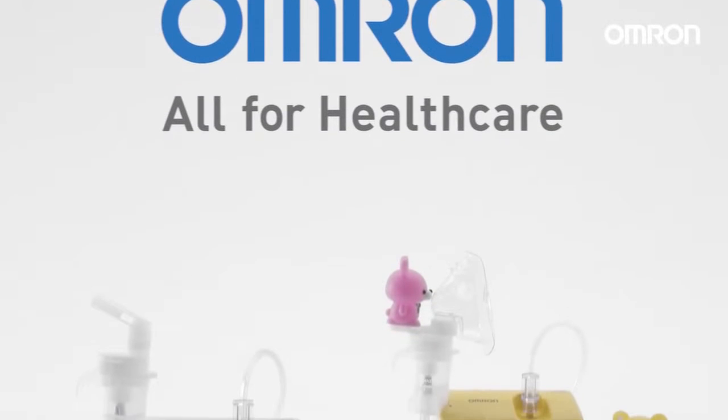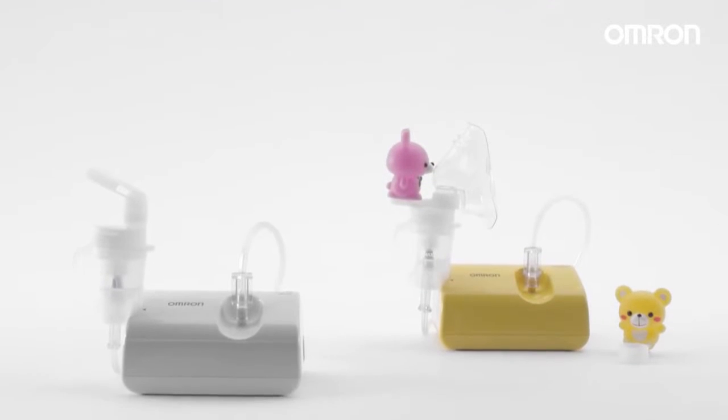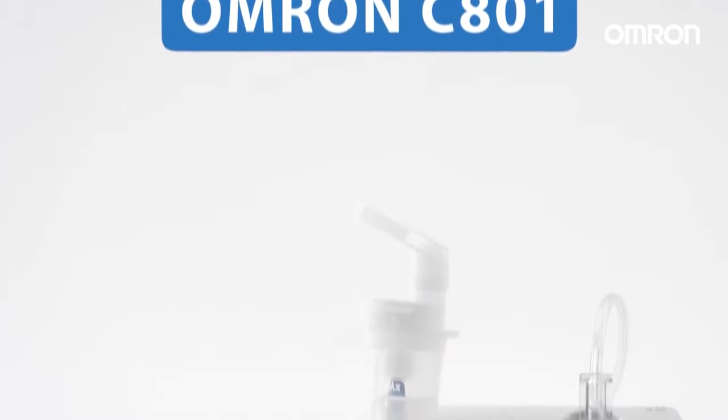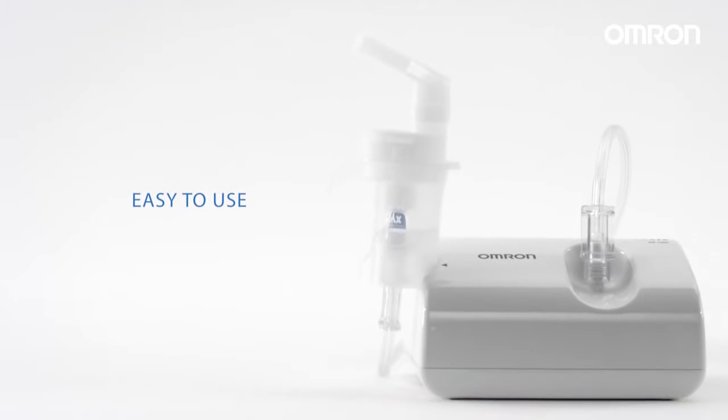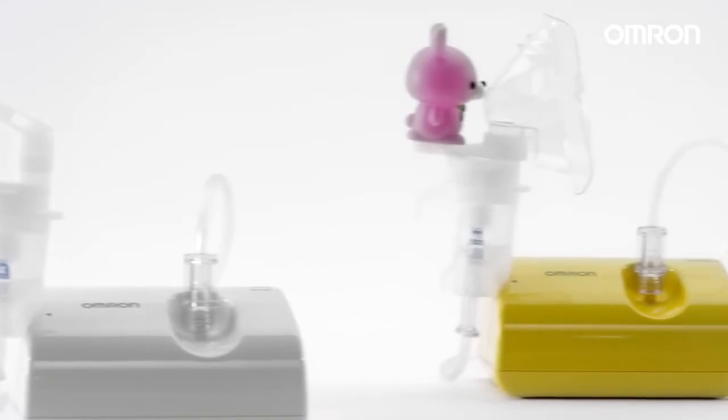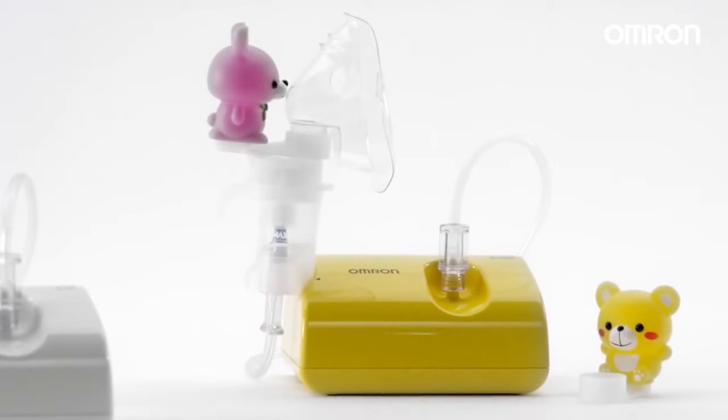Omron offers a versatile series of nebulizers for treating a wide range of respiratory diseases. The C801 is a very easy to operate, lightweight compressor nebulizer with Omron VVT technology and low noise operation. The C801 is available as a standard and special kids model.